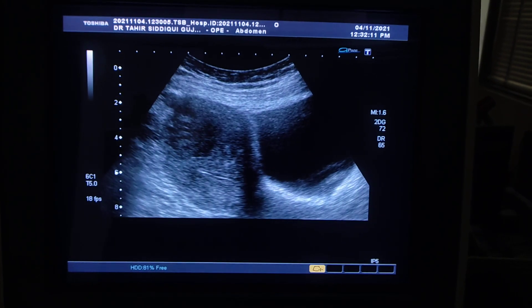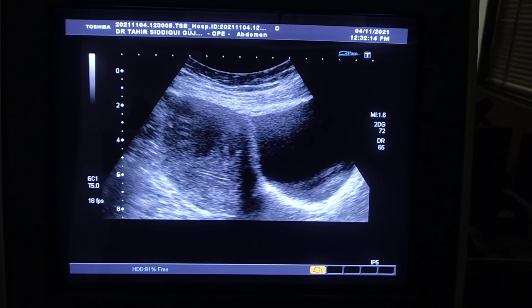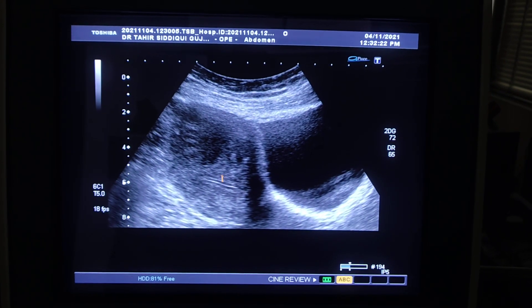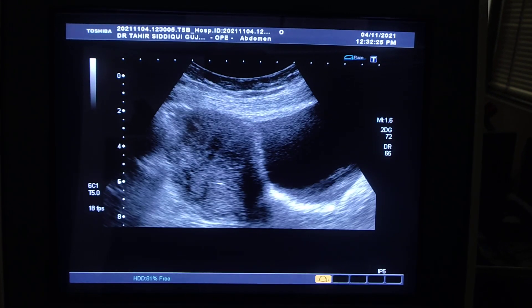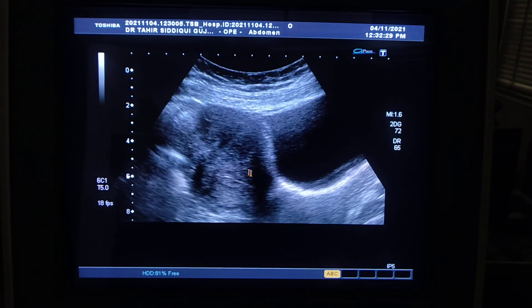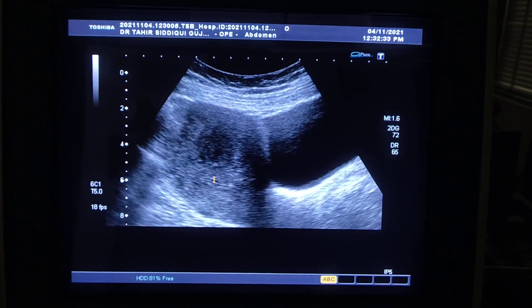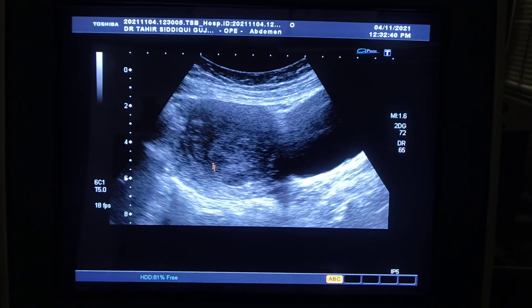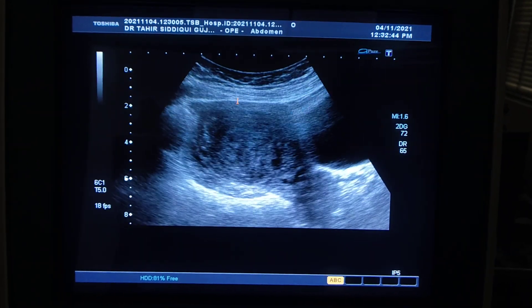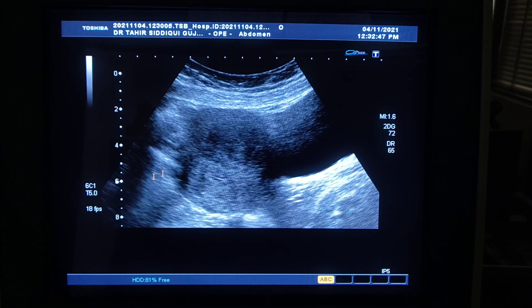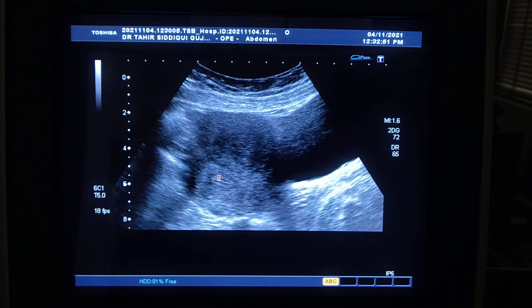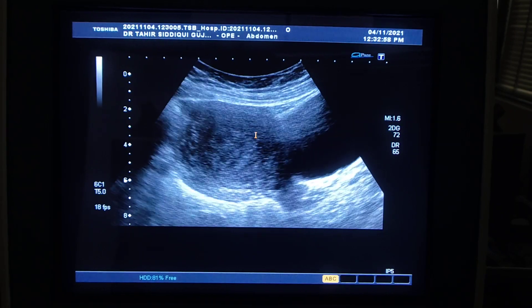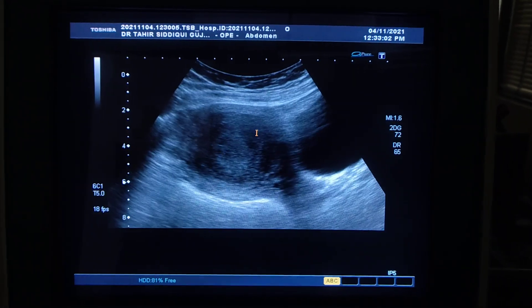I am going to show you the endometrial canal. This is the endometrial canal — it is clear. As I move the probe anteriorly upwards, this is the fibroid, this is the endometrial canal, and this is the posterior wall of the uterus. Here is the submucosal fibroid, showing a heterogeneous appearance.